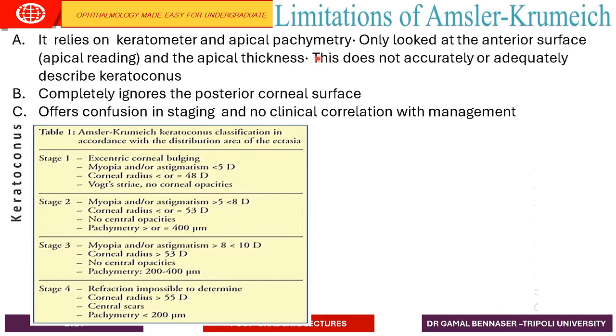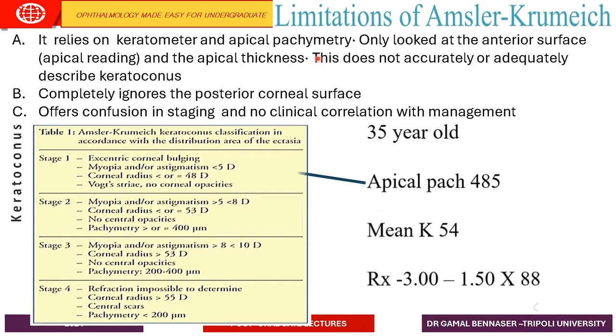The other thing is that it completely ignores the posterior corneal surface. Mainly, it depends on the anterior surface of the cornea, and this is a major drawback because the earliest changes will appear in the posterior corneal surface. Also, it causes confusion in the clinical correlation.